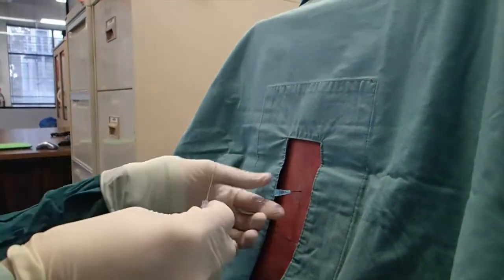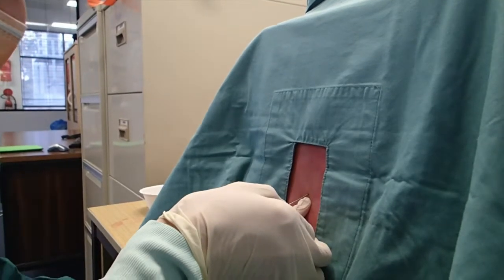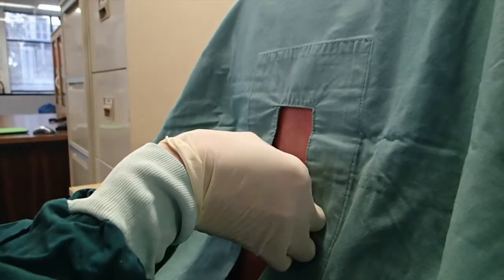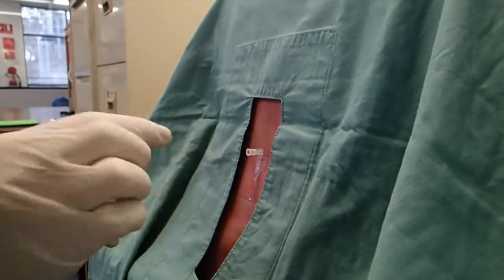Then I'm going to take that needle out and insert my introducer where it was. It's hard to see in this. So I'll go introducer, same spot. Feels like I'm in something hard which resembles a spinous ligament. Introducer, in this case I'm going to put it all the way in the hub, and notice I'm still in the midline.